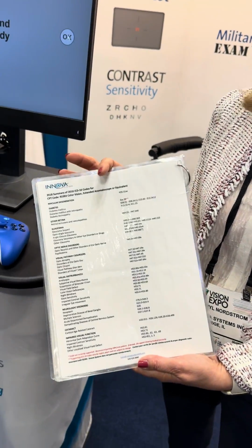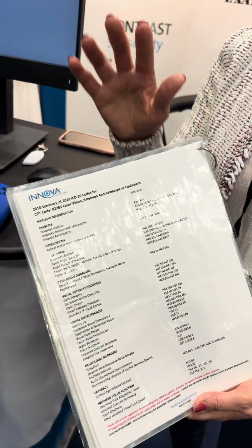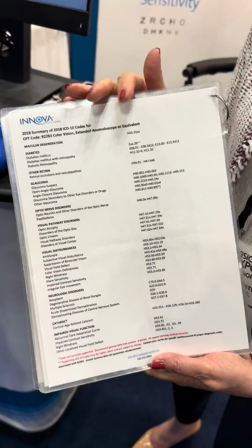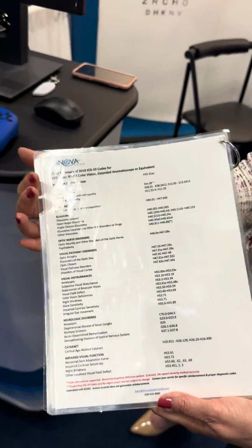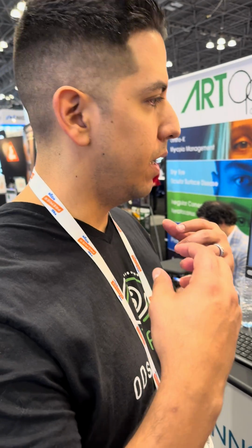A lot of doctors are just really adding a lot of clinical value as well as financial value. And I know that, Chris, you have it in your office, so if you want to talk about how you use it, that would be great. Sure, yeah. Really quick test. Evaluates retinal function. So probably the three biggest conditions we use it for are diabetes, diabetic retinopathy, macular degeneration, and more for glaucoma as well. It gives great clinical value so we can provide better care to our patients.